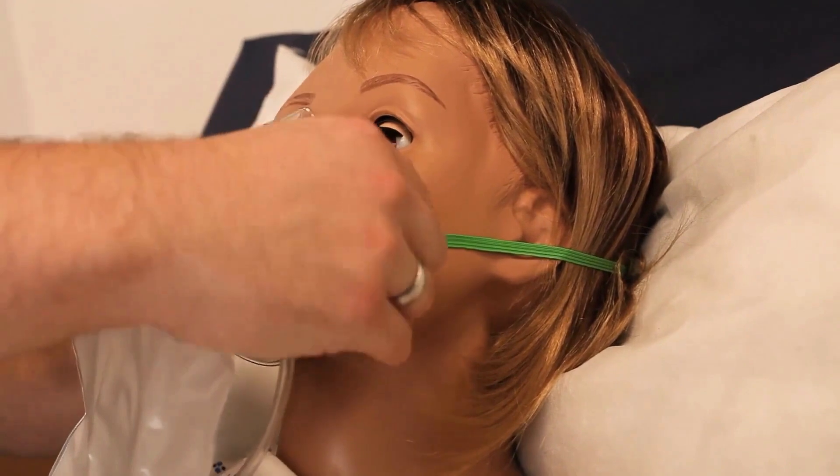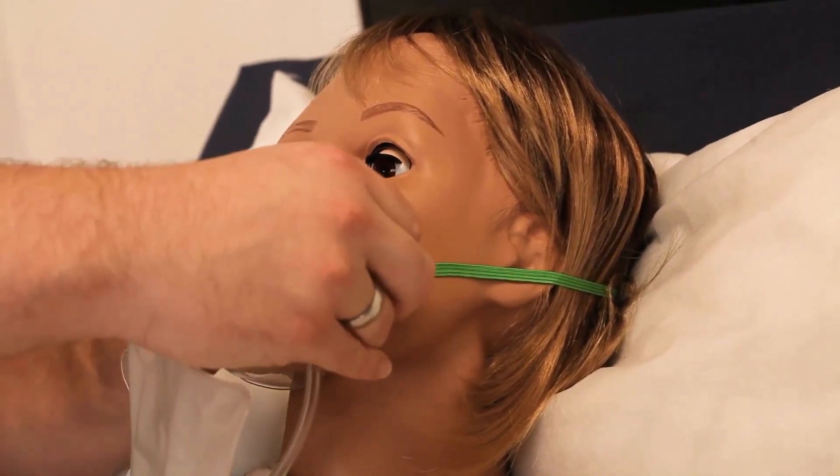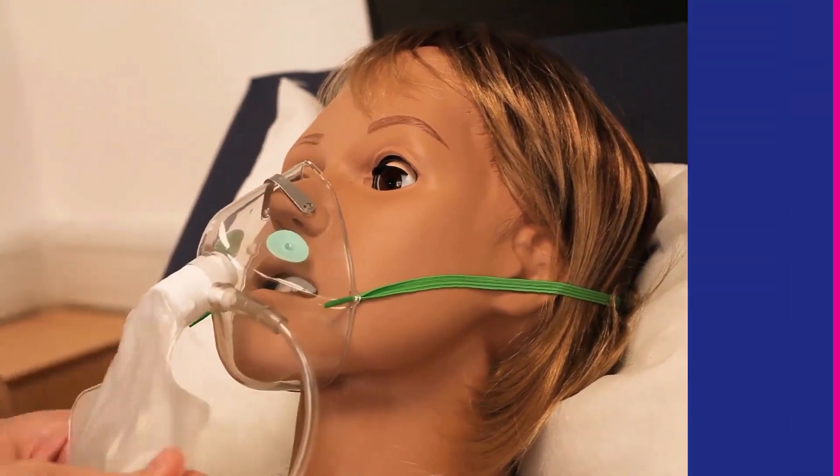Sophie, how does that feel — is that comfortable? Yeah that's fine, thank you. The bag is inflated and the oxygen is flowing.